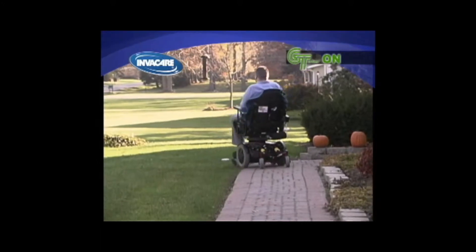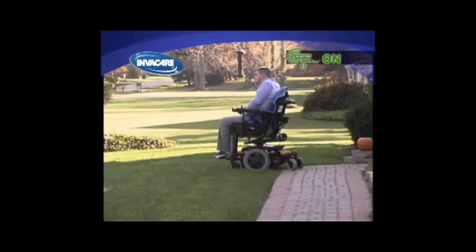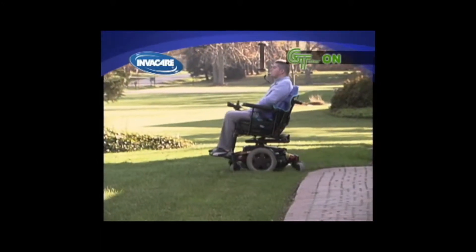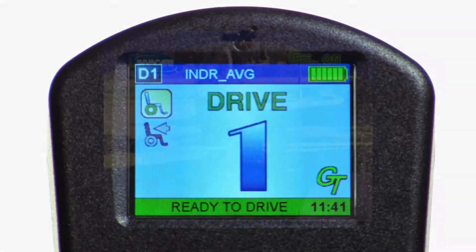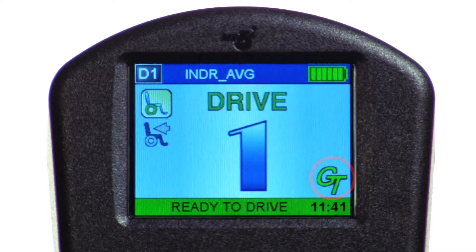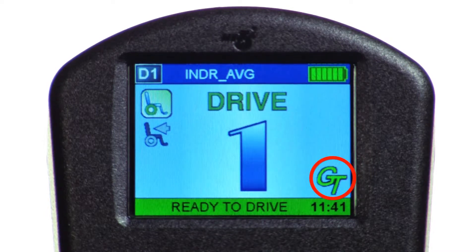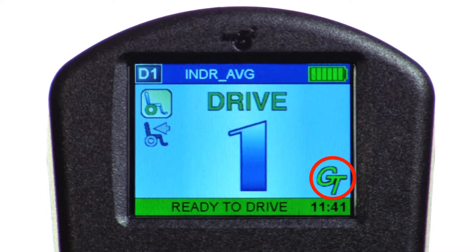You can quickly and easily determine if your Invacare power wheelchair is equipped with G-Track by the presence or absence of the G-Track symbol at the bottom right-hand corner of your MPJ joystick or display.